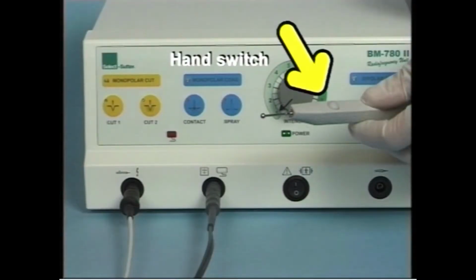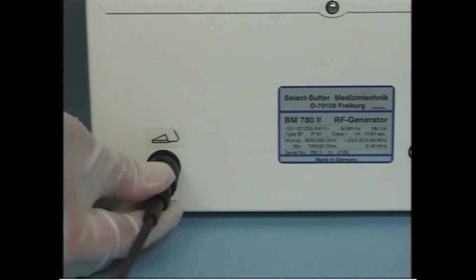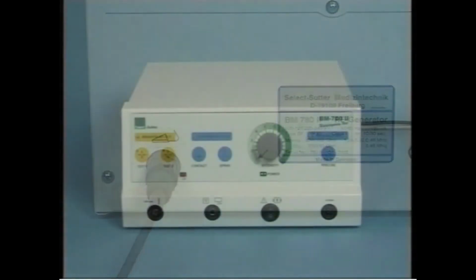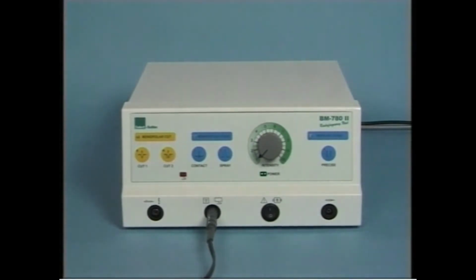If you decide to use the foot switch, place the foot switch connecting cable plug into the appropriate socket on the back of the device and fix it in place with a quick twist of the casing. Monopolar operation requires the patient plate to be connected to the appropriate socket on the front of the device. The warning light immediately goes out when it is linked with a standard patient plate.